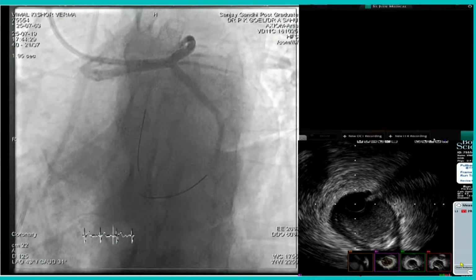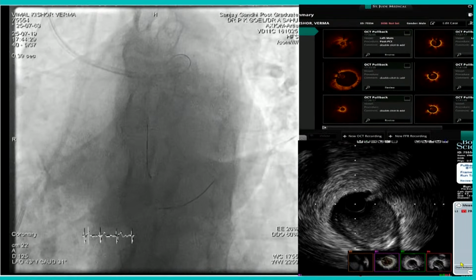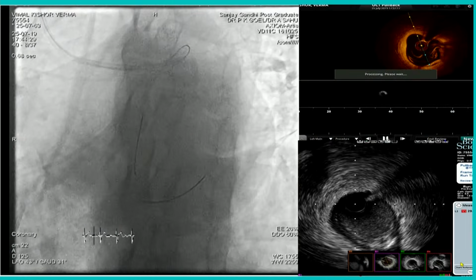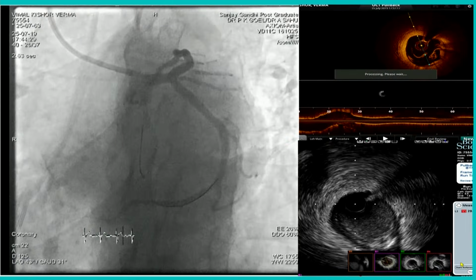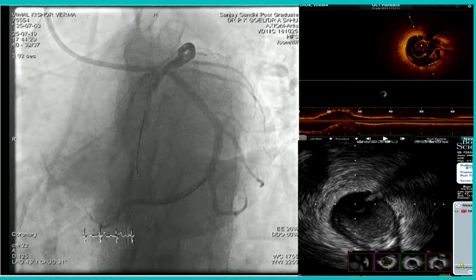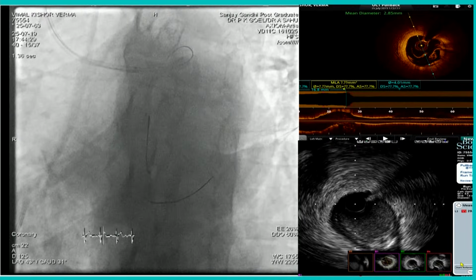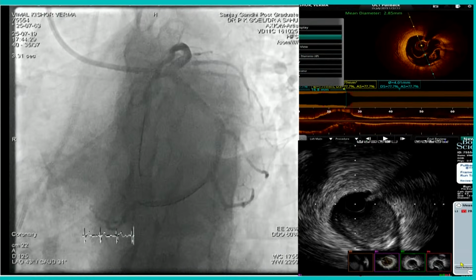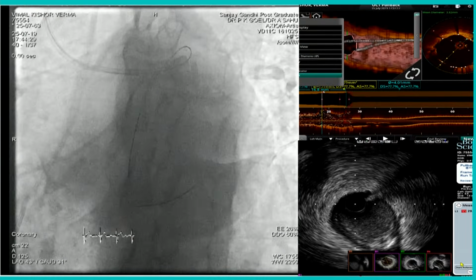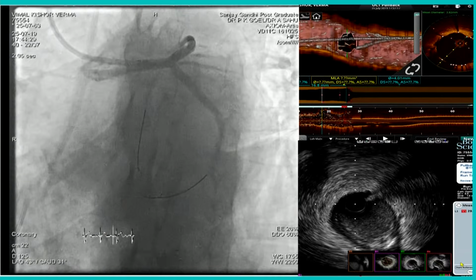On OCT, actually, post-stent OCT is, I think, good. Because sometimes OCT may not give you imaging to the depth or the 3-layer structure, so the sizing may not be correct at times. Although if you get the 3-layer structure, you can still get the sizing, and especially in left main. So what I usually like is, if it is post-stent, then OCT could be used.